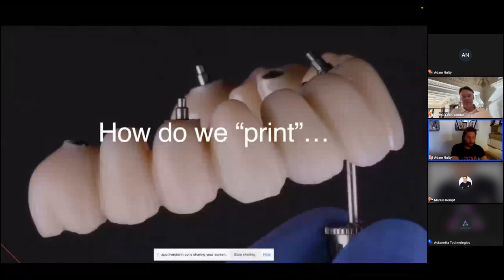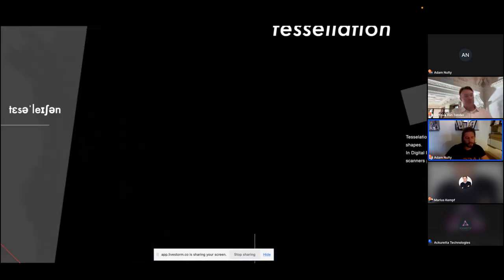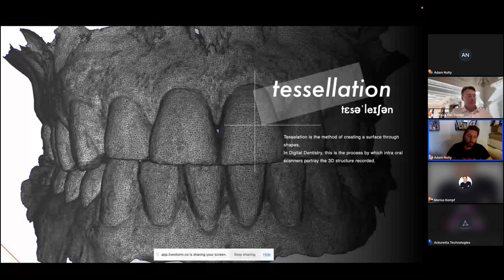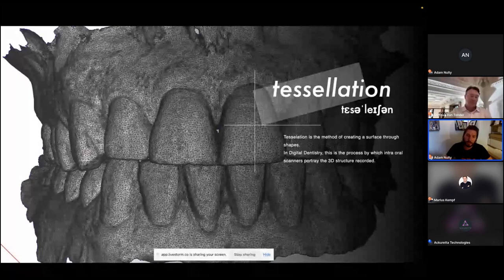So how do we go from the design, wherever it be from, to printing something that we can use, even for an implant provisional, or to print a model? How do we take it from a 3D object to a sliced and printed final object that we can hold in our hands? Well, the first thing that we have to understand is, what do we have when we take a scan? So I want you to understand what an STL is. Before we talk any more about 3D printing, it's really important that you comprehend the simple nature of what an STL, a 3D object, is.